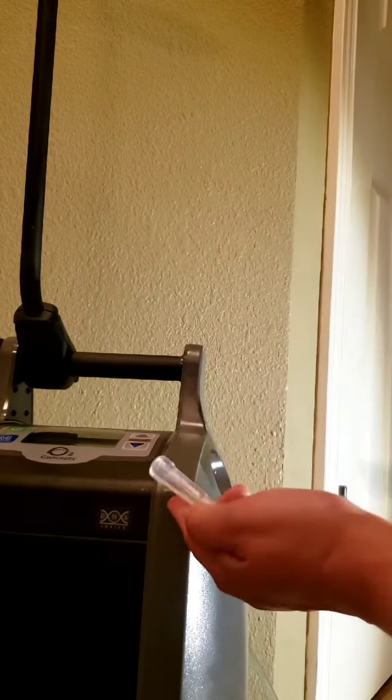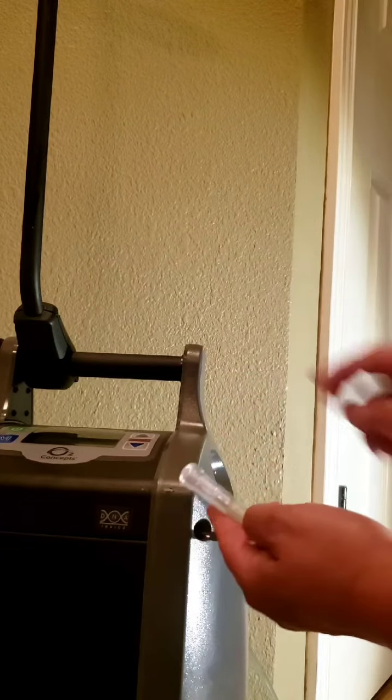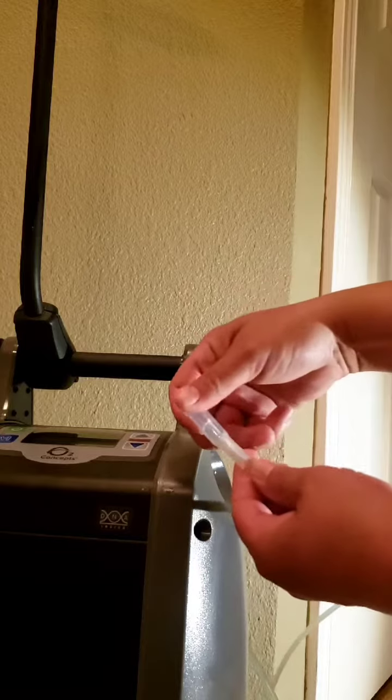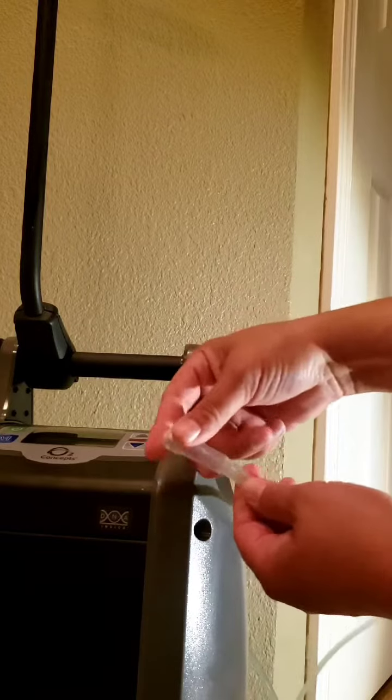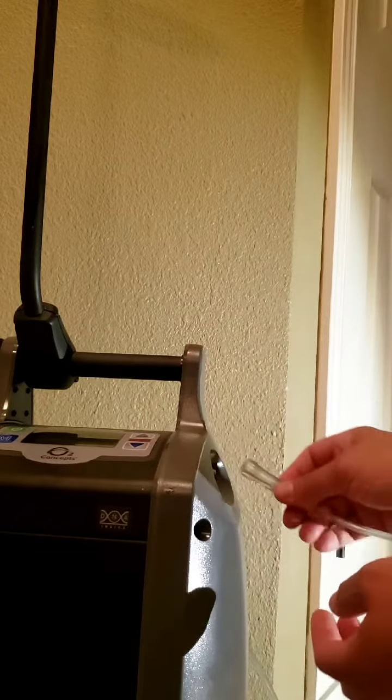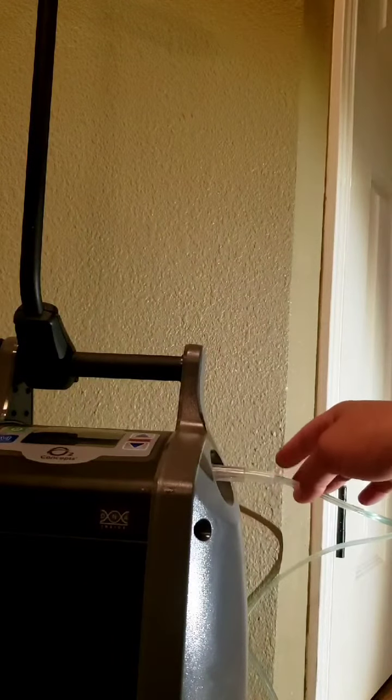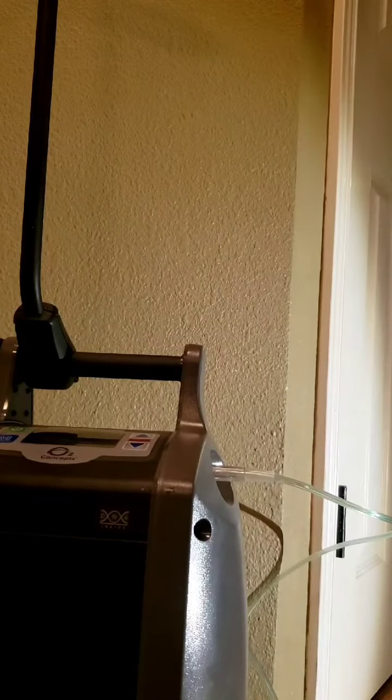snip the excess, your kink is gone, and you just reattach your tubing to the concentrator.